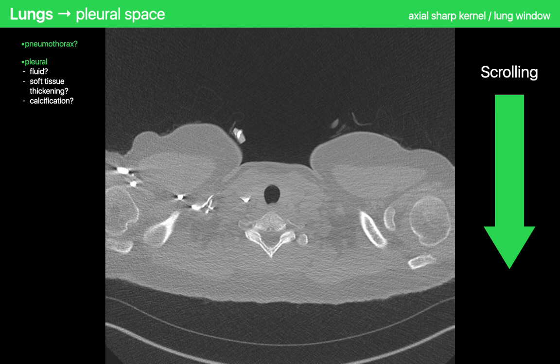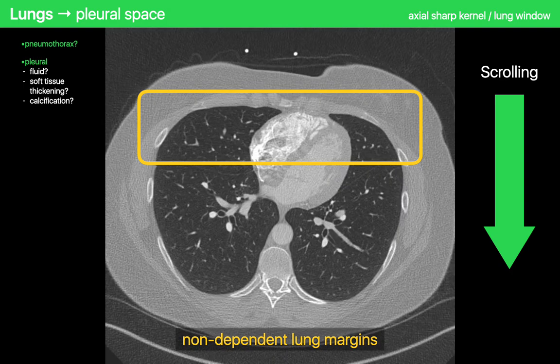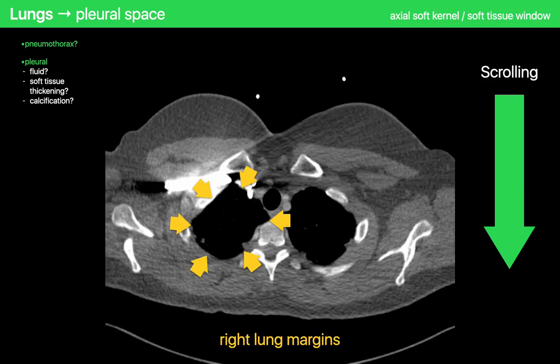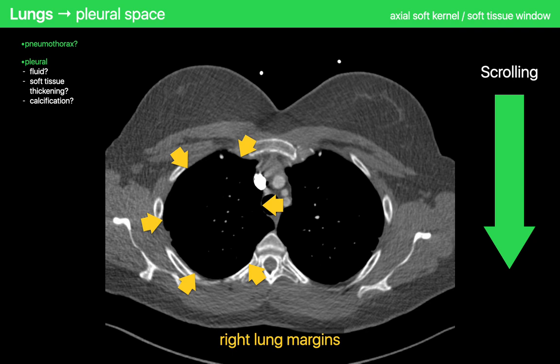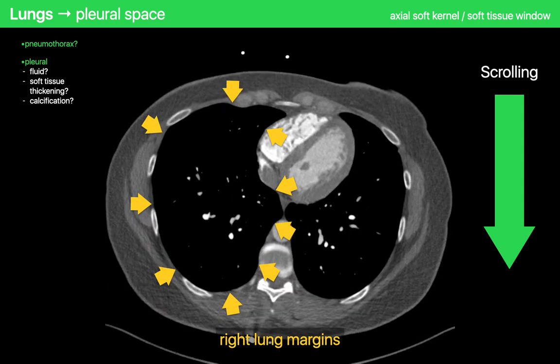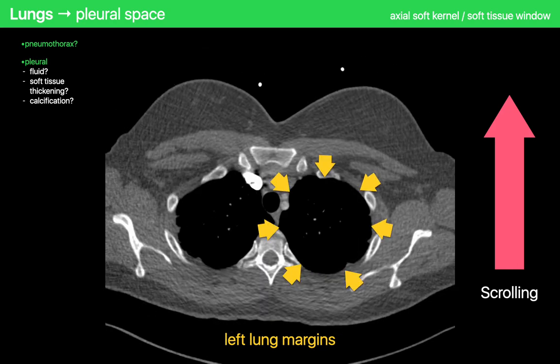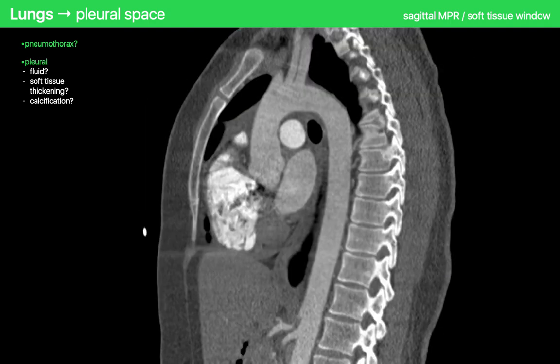Now that I'm done with airways, I begin assessing the pleural space, first looking for pneumothoraces. I focus primarily on the non-dependent portions of the chest where a pneumothorax would most likely accumulate, and I can usually do the right and left sides simultaneously. For the next part of the pleural assessment, I change to a soft kernel series on a soft tissue window to look for pleural fluid and pleural thickening — because sharp kernel images are too noisy, and on lung windows, pleural fat, pleural soft tissue, and pleural thickening all look similar. I prefer to do one hemithorax at a time, and I may also inspect the pleural spaces on the sagittal MPR.